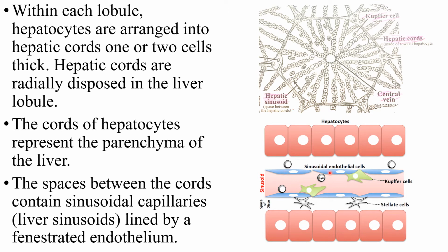And these liver sinusoids are lined by the endothelial cells. The endothelial cells are the cells of the blood vessels but are discontinuous in nature, and hence they are called fenestrated endothelium.